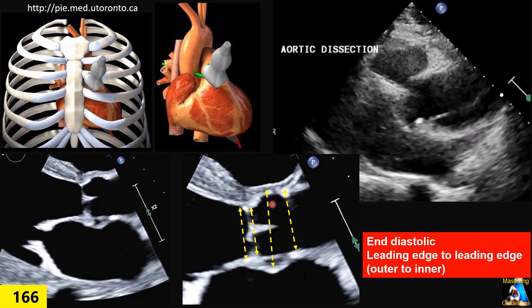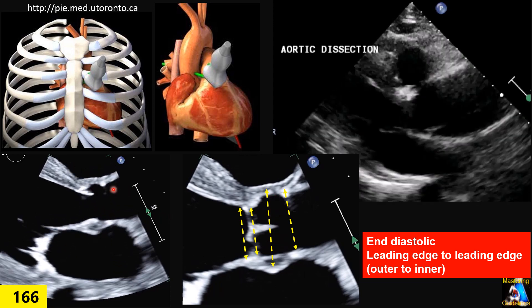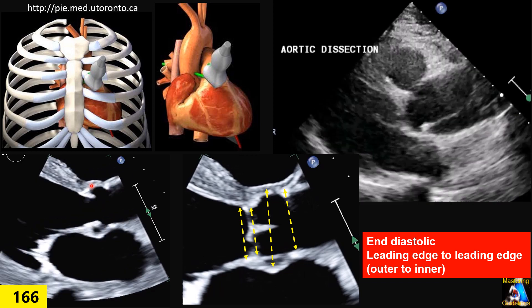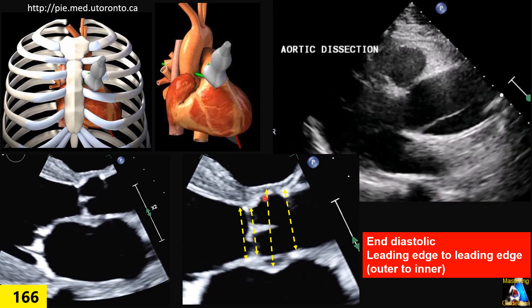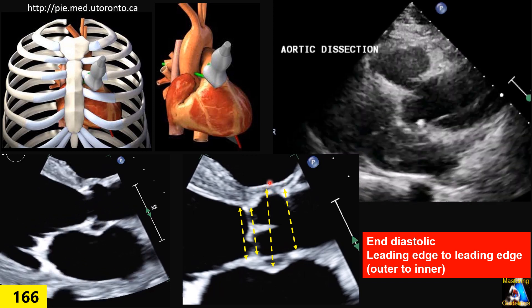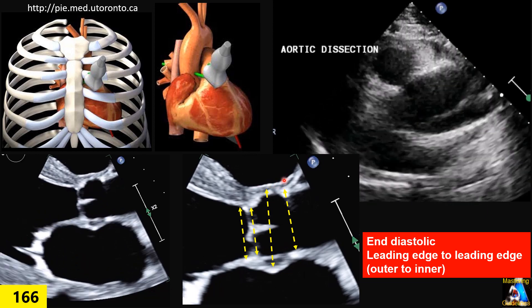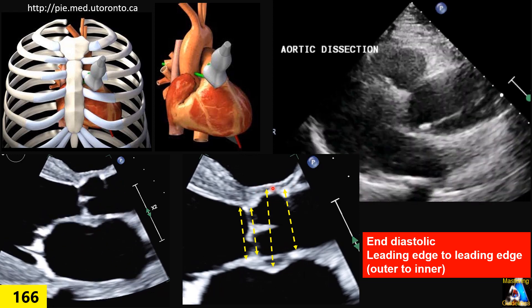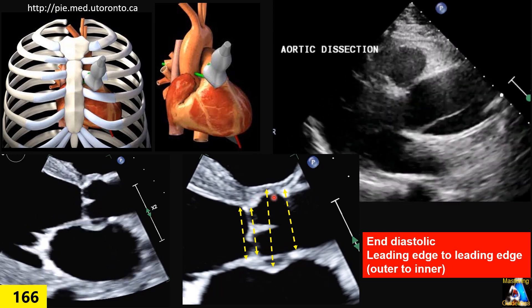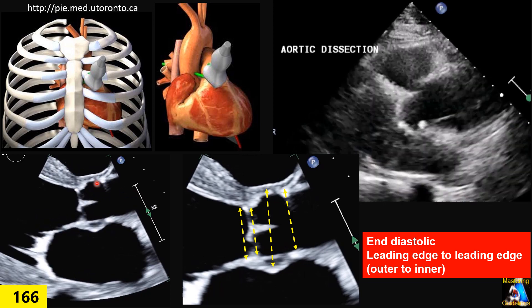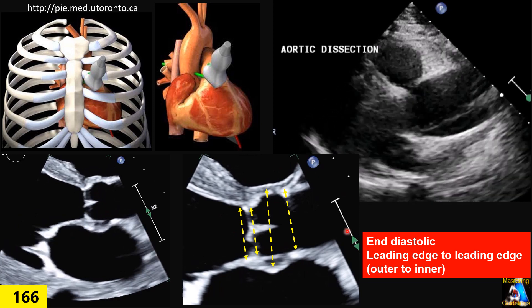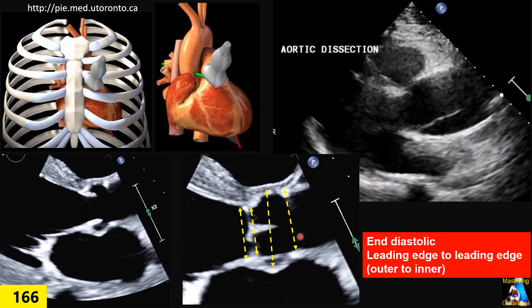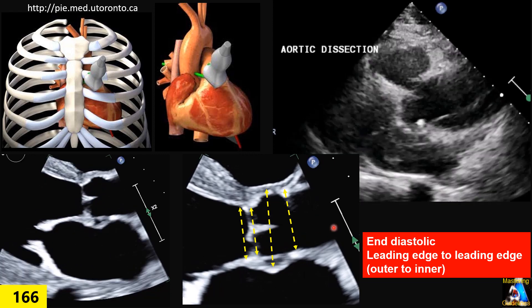A tip on measuring the sinus of Valsalva: go through the loop back and forth to confirm where the aortic wall is at the level of the sinus. You can follow it, and when you identify where the aortic wall is, place the caliper outer to inner. There are three layers visible: the RVOT, the connective tissue between the RVOT and the aortic wall. Using zoom mode makes it easier. Measure outer to inner at that level.